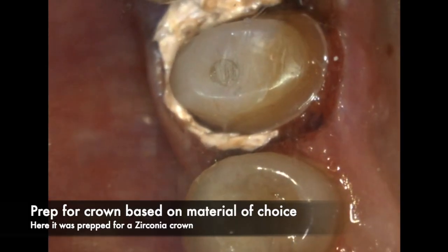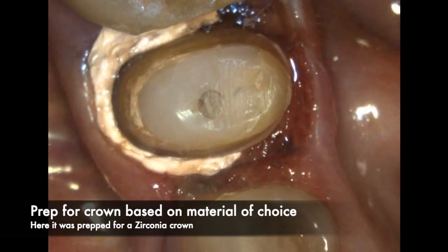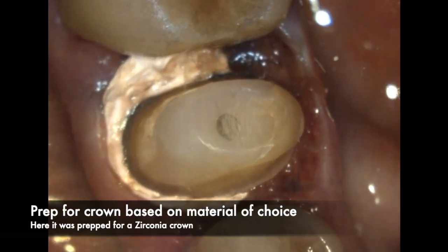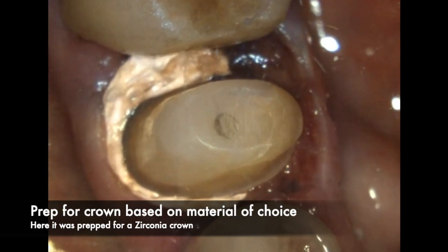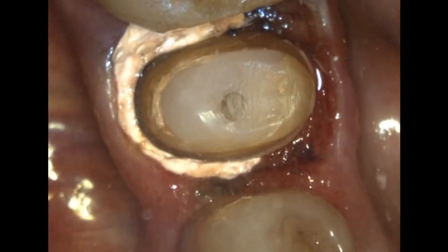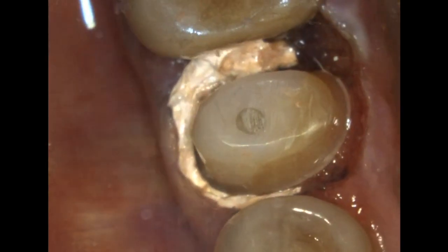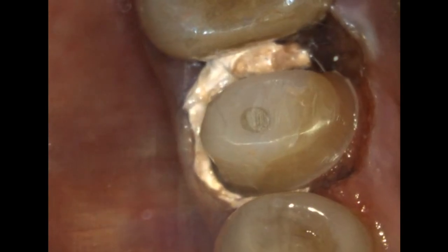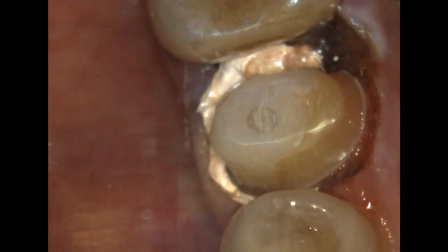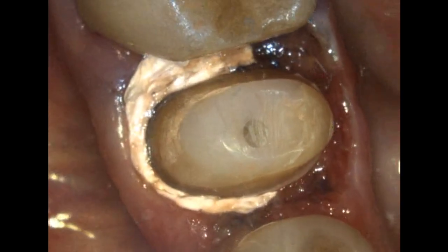After the buildup material is placed, go ahead and prep for the kind of material you want to choose. In this case I am prepping for a zirconia crown. If you haven't watched my video on how to prep for a zirconia crown, I'll post the link in the comments — you'll see what burs I use and what order I use them in to get very nice and precise margins.